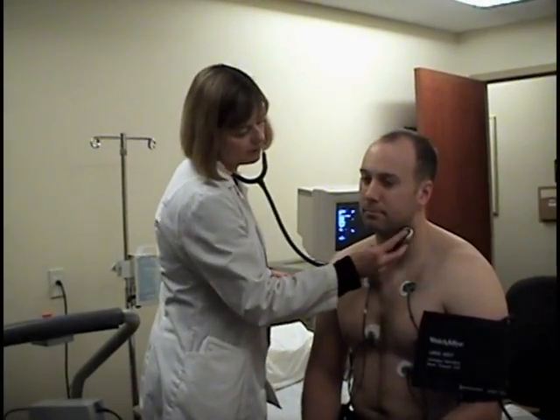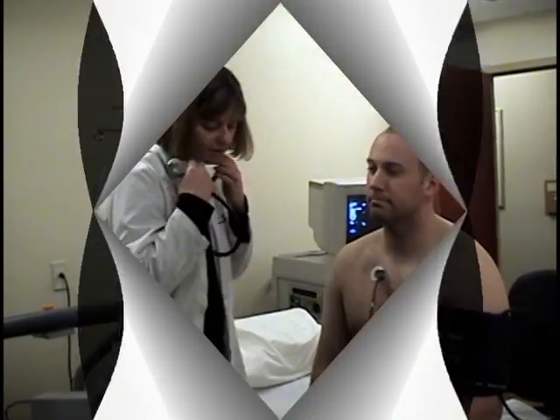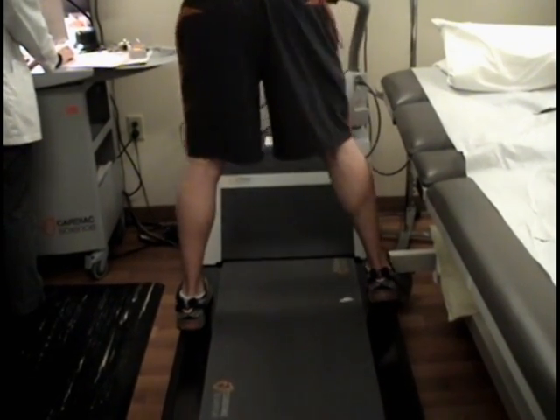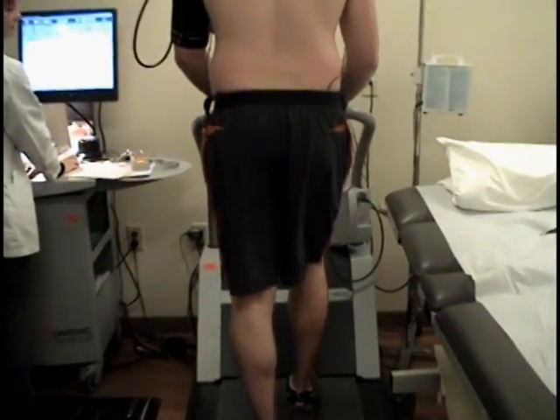A nurse will then check your vitals and prepare you for the treadmill portion of the test. We do ask that you begin with your feet placed on either side of the treadmill until the belt slowly begins to move.